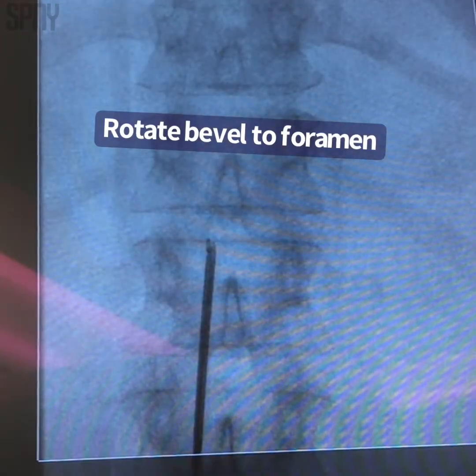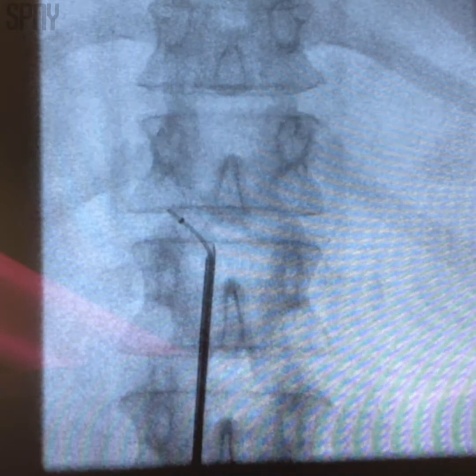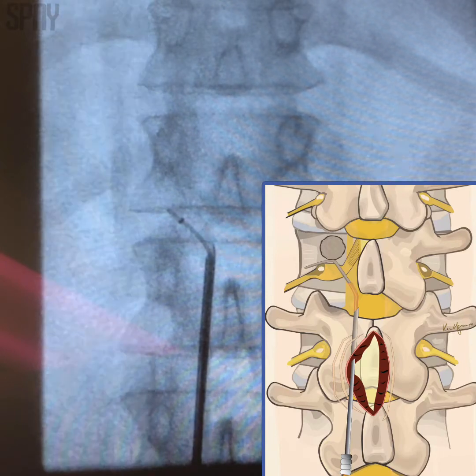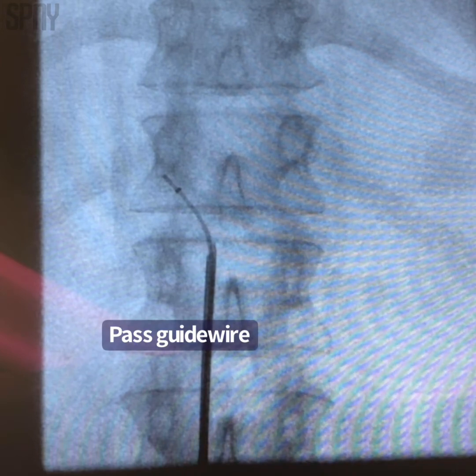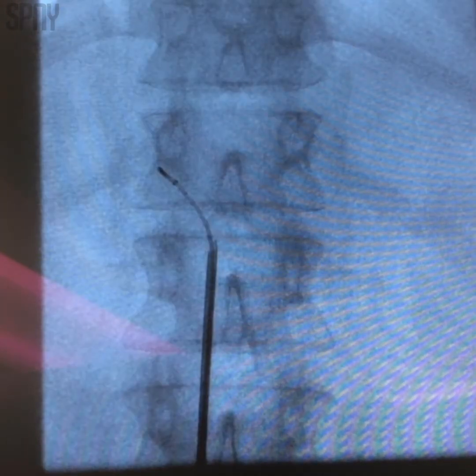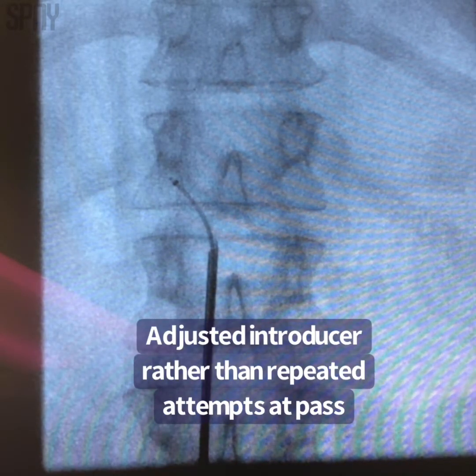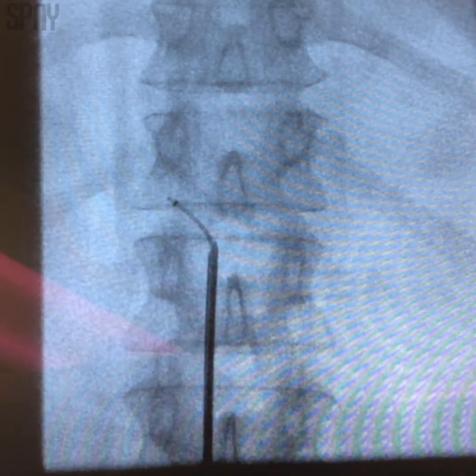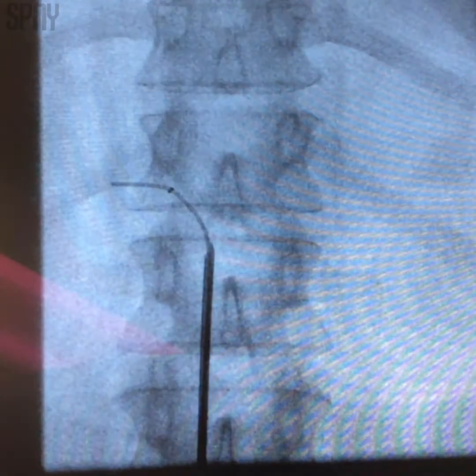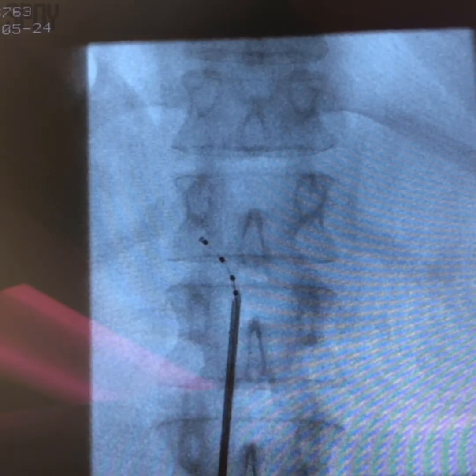Turn everything towards our target. Elizabeth, you okay down there? Good. You're doing great, okay? You know if you have any pain or discomfort, okay?